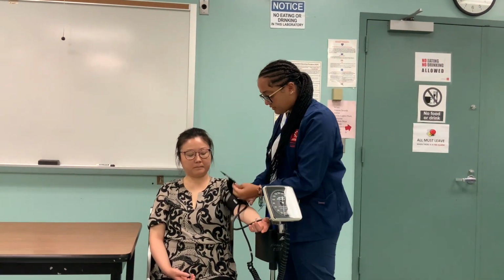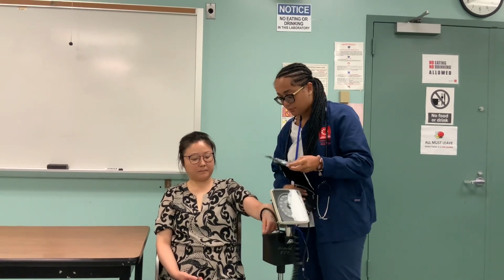And then once you're done, you would take off the cuff to relieve the pressure that they just felt. You would thank your patient, and you would wash your hands upon exiting the room, and you would always clean the blood pressure machine. So you would wipe down the blood pressure cuff and everything that was touching the patient.